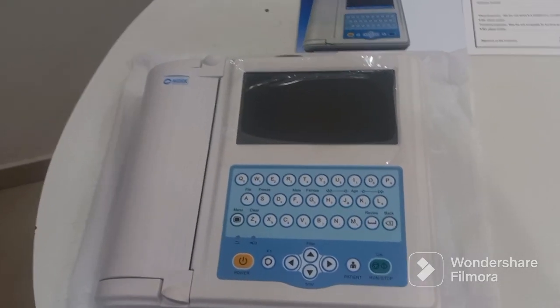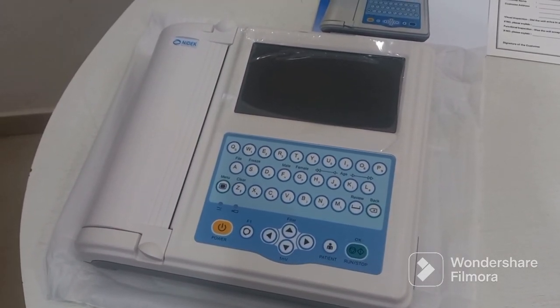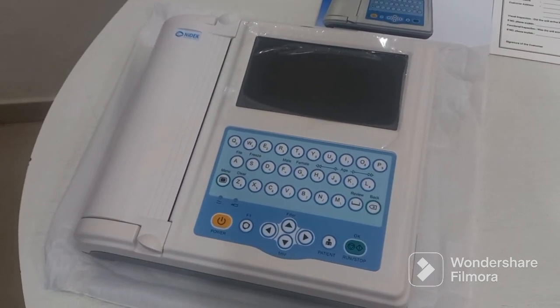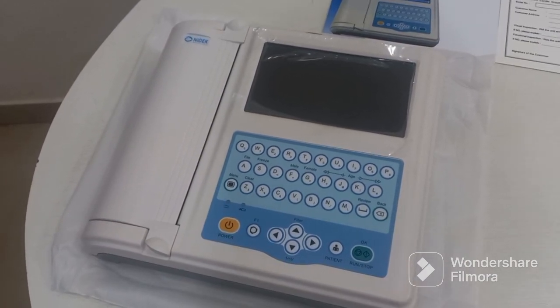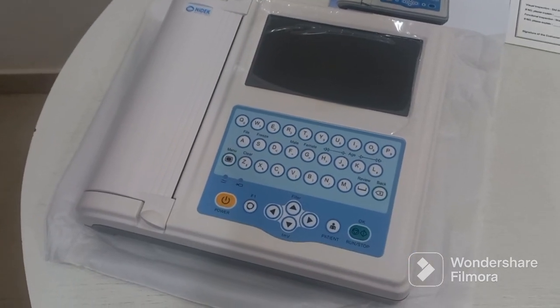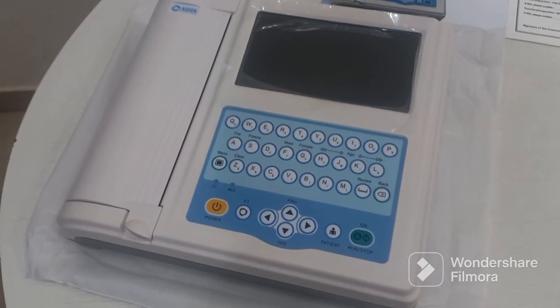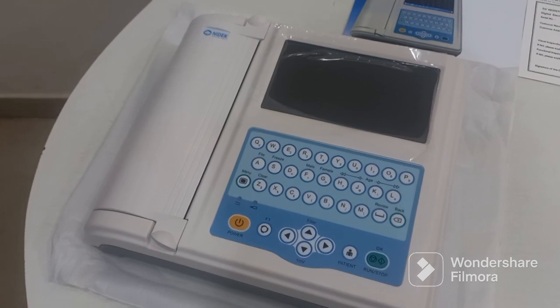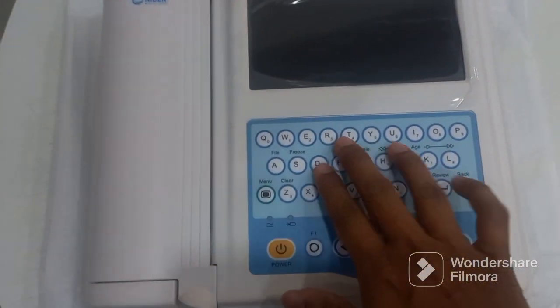This ECG machine is a Nidek 12-channel ECG machine and it is one of the basic diagnostic tools for cardiologists and general physicians. It can be used to perform all routine diagnostic checks and it is very simple to use and very precise, as this machine has a sampling rate of 4000 Hz per channel. The paper size is a standard 210mm by 30m and it has a 7-inch LCD screen with storage for 250 ECGs.